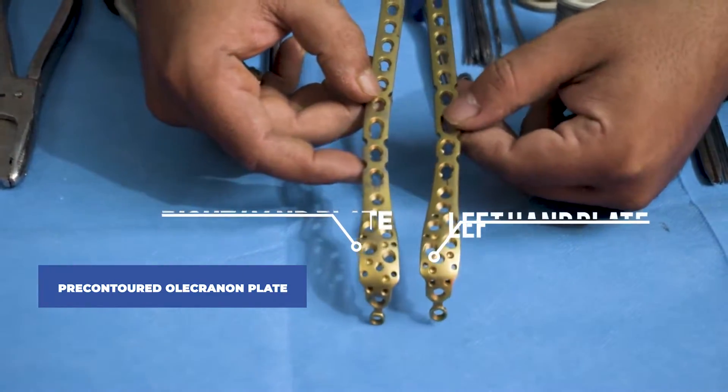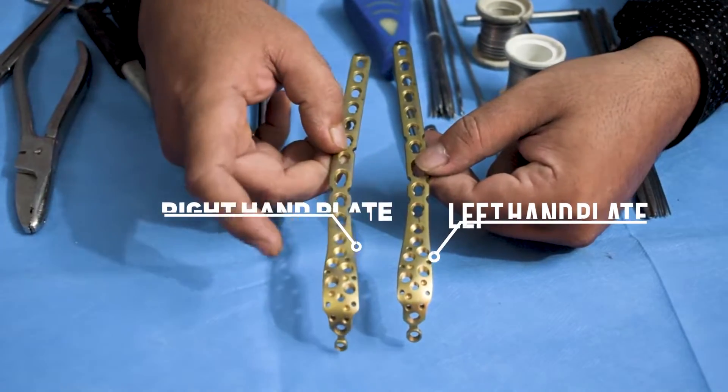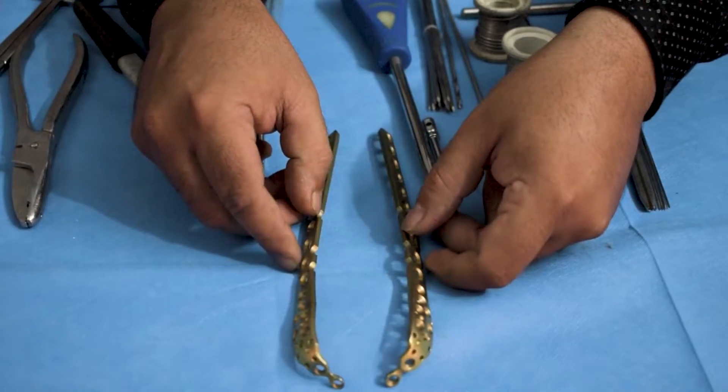It is side-specific, meaning it has a specific left and right because it is designed as per the curvature of the bone, and this is already indicated on the plate. Now we will see the fixation of this plate using the instruments.